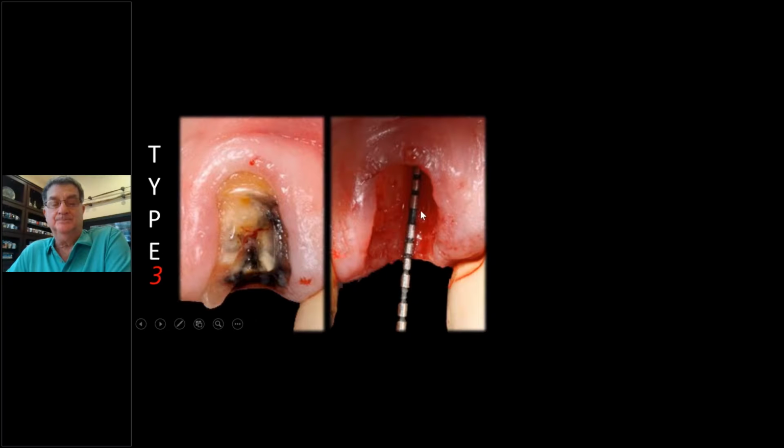What I'm going to do is take it out. Now, this is the key. The palatal tissue is still there, even though the buccal is gone. See that palatal tissue and some bone. This is beautiful. That's the height that you're going to reach. Mother Nature is going to fill this in with beautiful keratinized tissue, not mucosa.